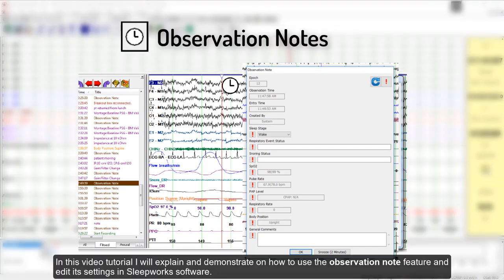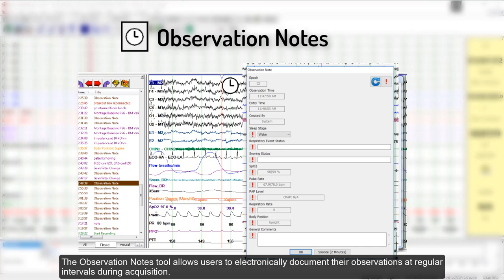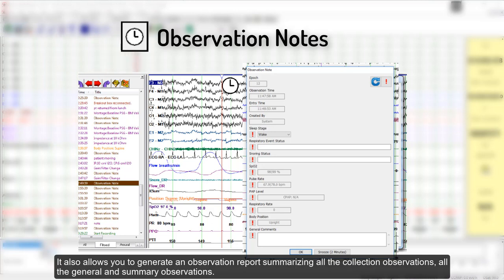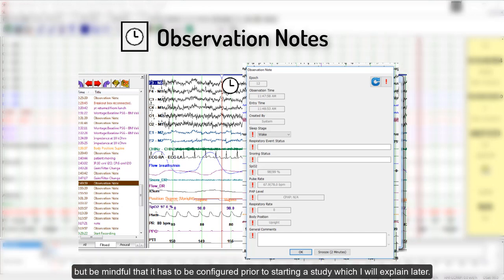In this video tutorial, I will explain and demonstrate how to use the Observation Note feature and edit its settings in SleepWorks software. The Observation Notes tool allows users to electronically document their observations at regular intervals during acquisition. It also allows you to generate an observation report summarizing all the collection observations, all the general and summary observations. The information collected in the observation notes and the intervals at which the note appear are customizable, but be mindful that it has to be configured prior to starting a study.